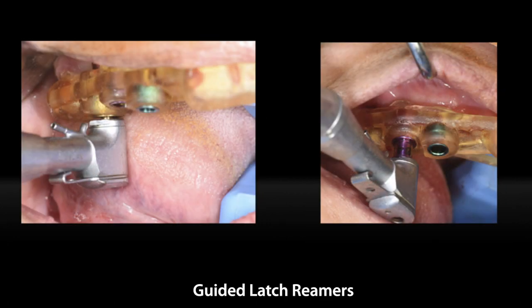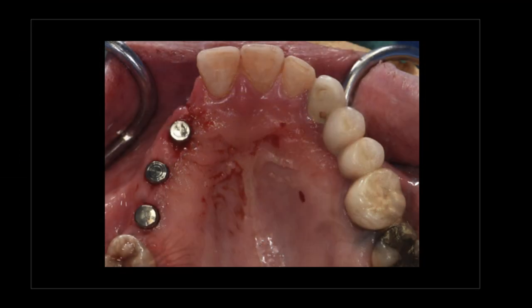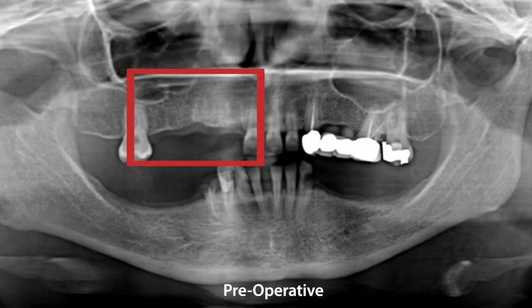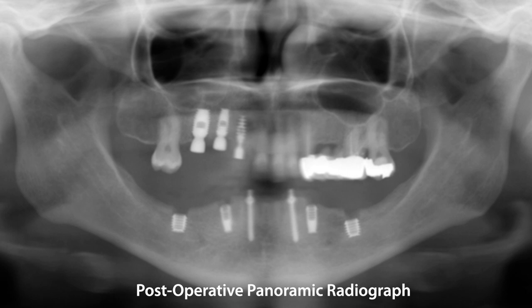Widening the osteotomy using the different reamers which are available in the guided surgery kit. Guided implant placement using the guided implant inserter, attaching immediately the temporary abutment. And here, if you decided to perform a two-stage surgery, you might return the cut keratinized tissue and stitch it back in place. And this is the patient's pre-operative virtual plan and the post-operative OPG showing implants nicely placed and parallel to each other at the upper right side.